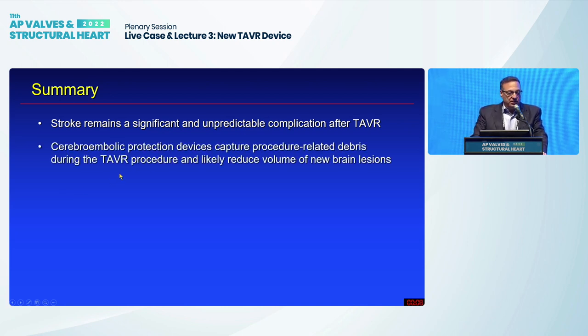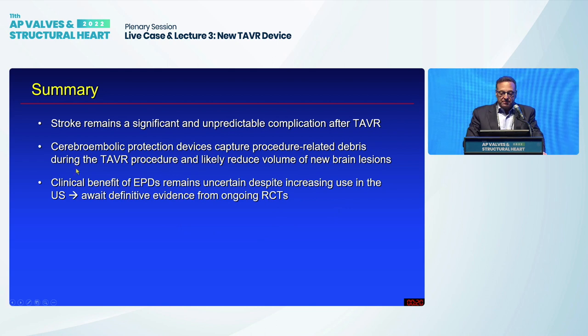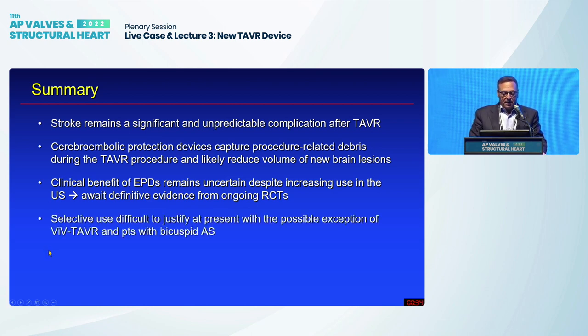There is no question that our current generation of cerebral embolic protection devices do capture debris during a TAVR procedure, and likely, although not for sure, reduce the volume of new brain lesions. However, I would say still, about 4 years after their release, the clinical benefit of embolic protection devices remains uncertain despite increasing use in the United States, and we really are awaiting the definitive evidence.